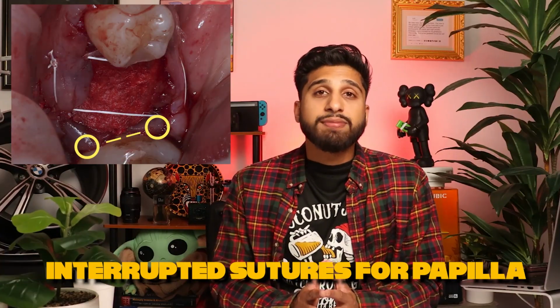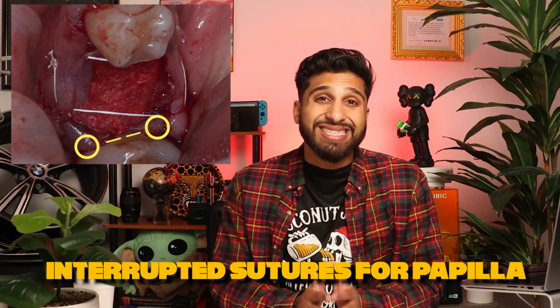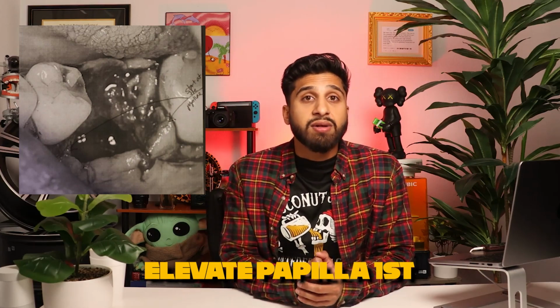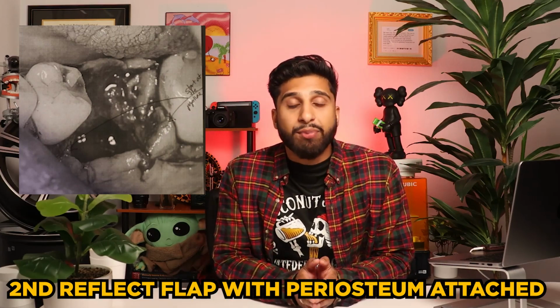And the papilla aren't closed properly either. Place interrupted sutures to close the papilla that you incised. So after using the 15 blade to incise, elevate the papilla off first with the periosteal and then try to reflect the flap with the periosteum attached. And here she lays out the numbers for me on the flap on how to create a smoother, cleaner flap.